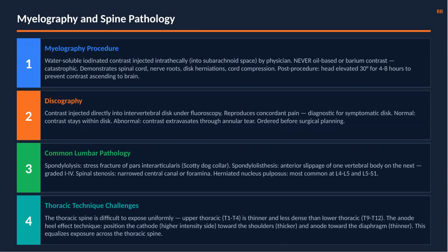For clinical concepts, myelography. Water-soluble iodinated contrast injected intrathecally into the subarachnoid space by the physician. Never oil-based contrast, never barium. Water-soluble contrast is absorbed safely. Post-procedure, head elevated 30 degrees for 4 to 8 hours to prevent contrast ascending to the brain. Demonstrates spinal cord, nerve roots, disc herniations, and cord compression.